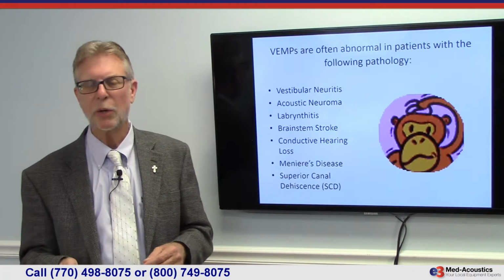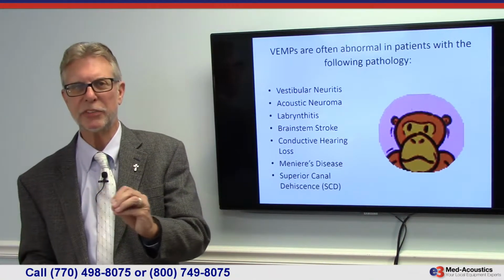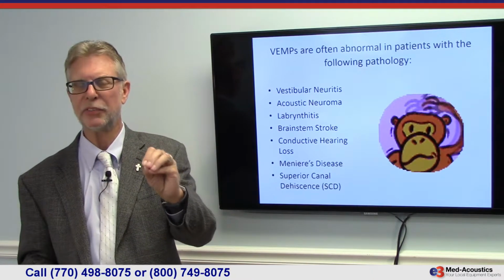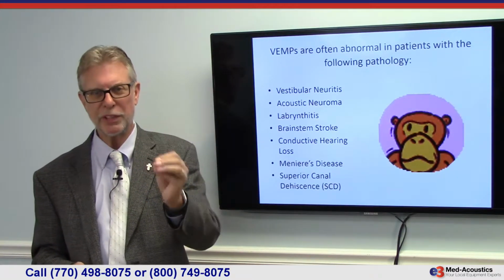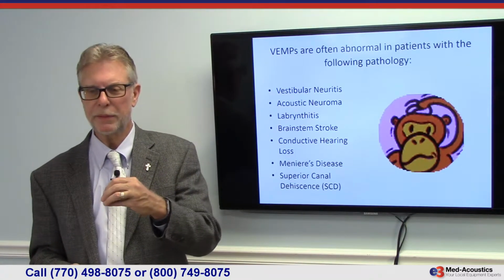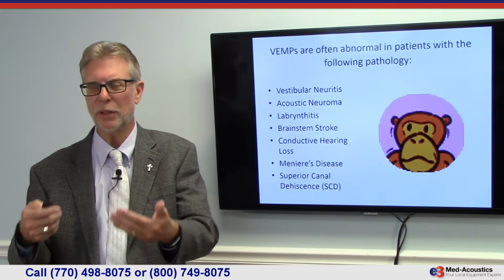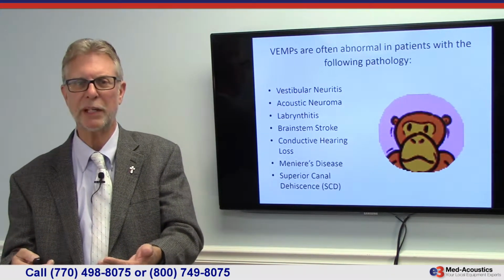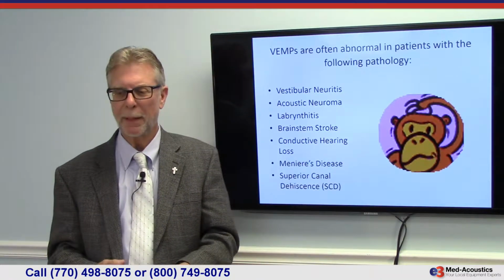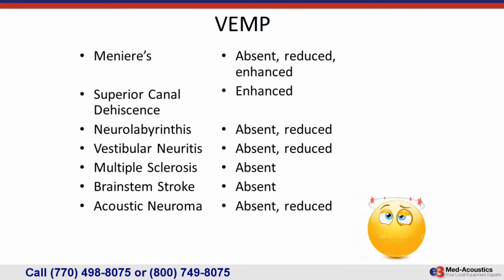And so this is another reason why you don't do any of these tests in isolation. In other words, do only a CVEMP, right? We need a CVEMP, an OVEMP, a VNG, of course. We need to know the patient's history, and a doctor needs to do a physical examination. All together, even with the audiology information, we can come to a conclusion. And this is what will happen.